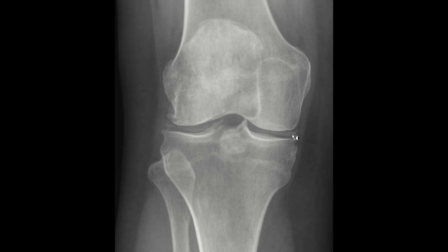We can see here in the area of the medial meniscus as well as the lateral meniscus that there is a faint density. It's not as dense as bone, but much denser than the surrounding soft tissues, suggestive of mineralization.